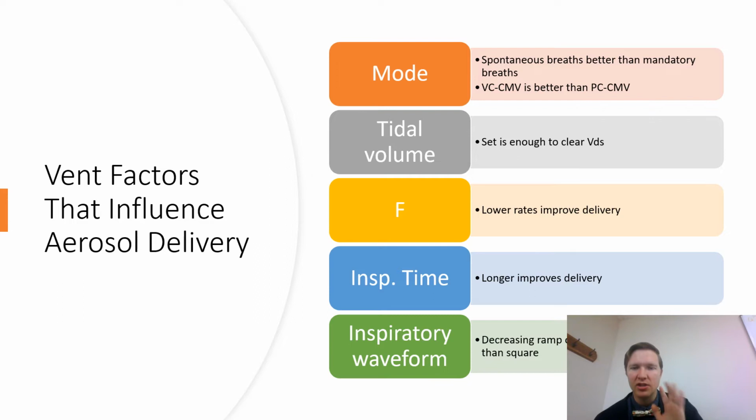Another way to think about this, try to breathe really fast right now. What are you doing? You're exhaling quite a bit, right? You're exhaling quite a bit when you're breathing fast. So if I'm spending most of my time exhaling, what happens to my inhaling time? Time yourself with how long it takes for you to inhale when you're breathing fast compared to when you're breathing slow, like a rate of 10. You're going to have a much longer inspiratory time constant. You're not going to be exhaling that gas nearly as fast. So that gives the medication more time to deposit, more time to distribute when they have a slower respiratory rate.